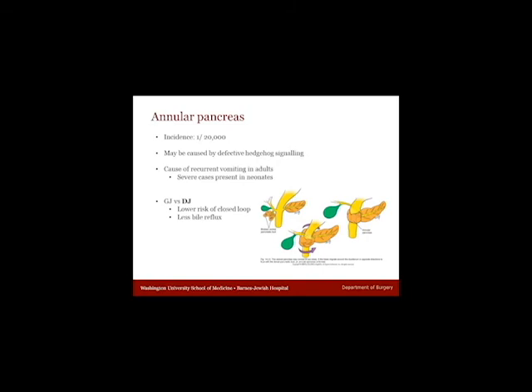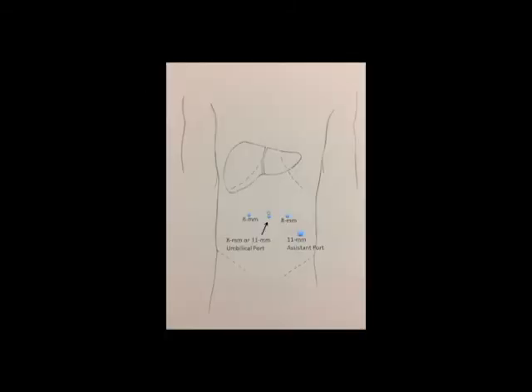A duodenal jejunostomy was preferred here. Ports were placed as described in the picture, including an 11mm assistant port to facilitate subsequent robot docking.